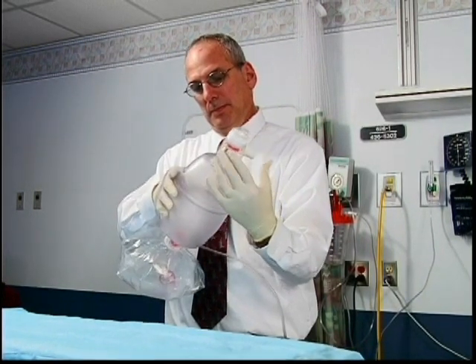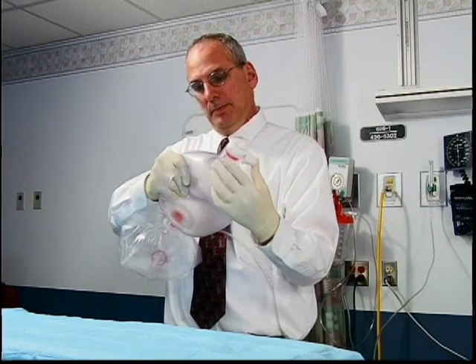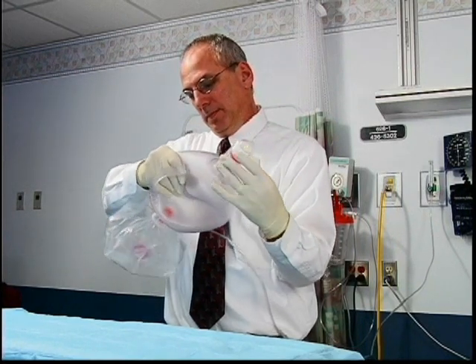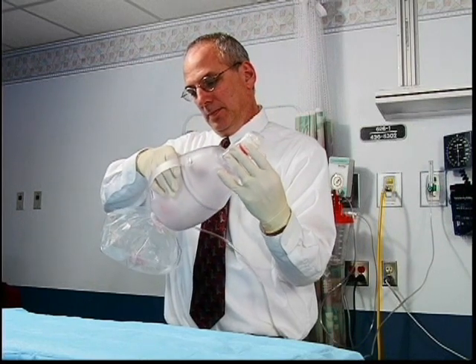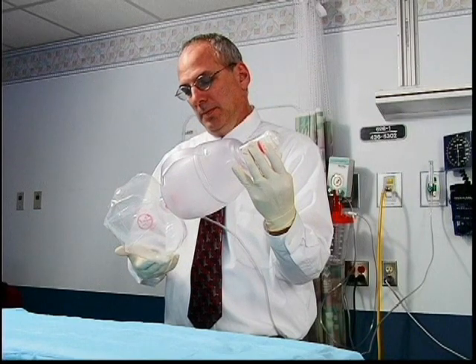Remove your thumb and squeeze the bag again. With the bag deflated, place your thumb over the outlet again. If the oxygen flow is adequate, the bag should reinflate quickly and completely within a few seconds, drawing oxygen from the reservoir attached to the rear end of the bag.